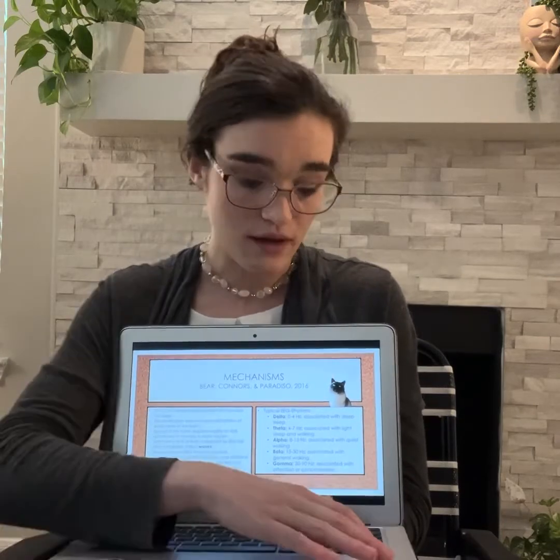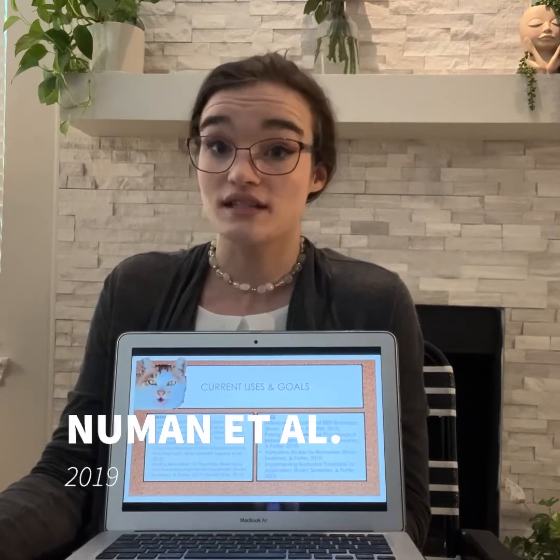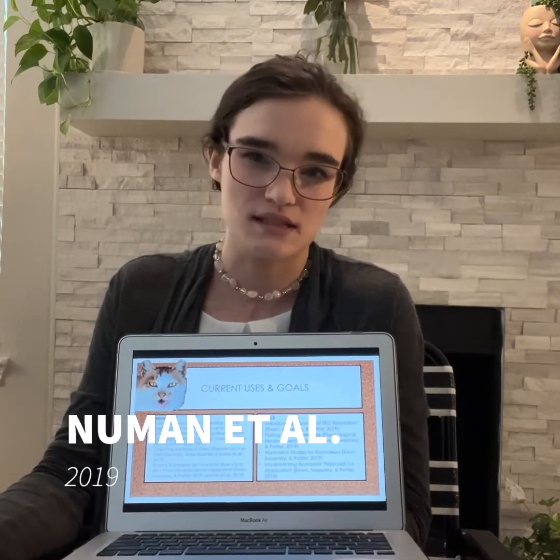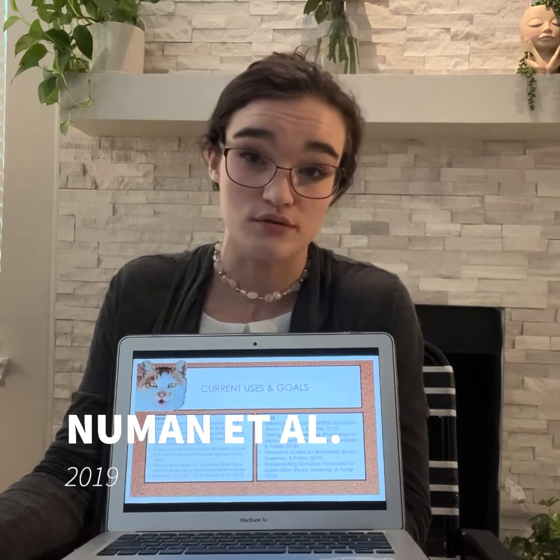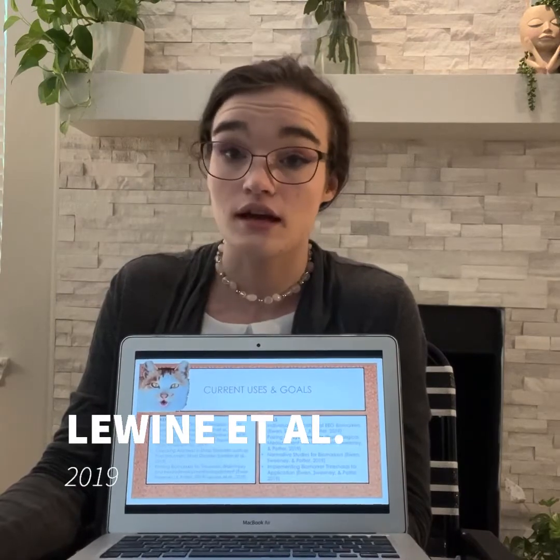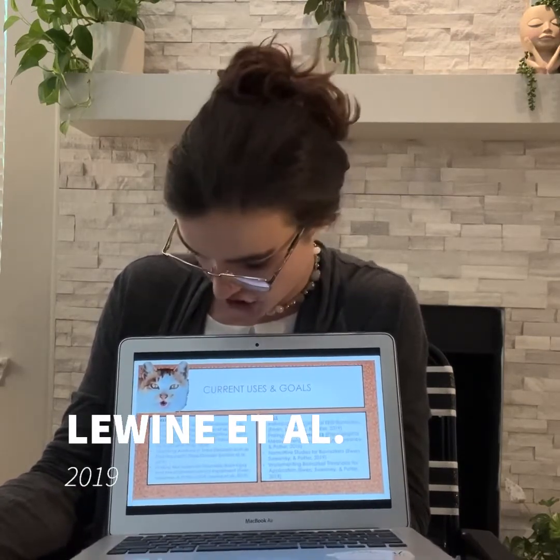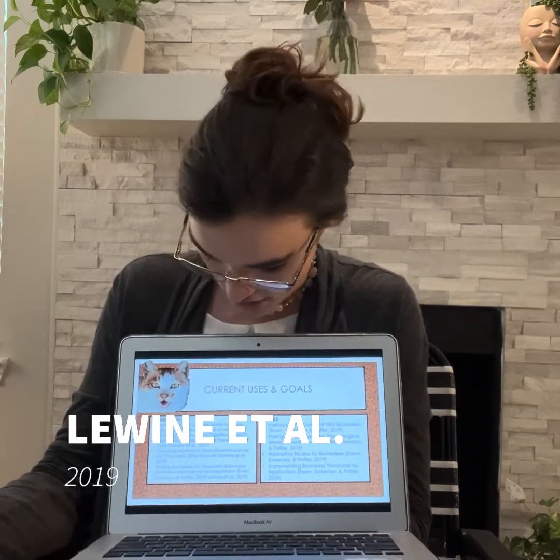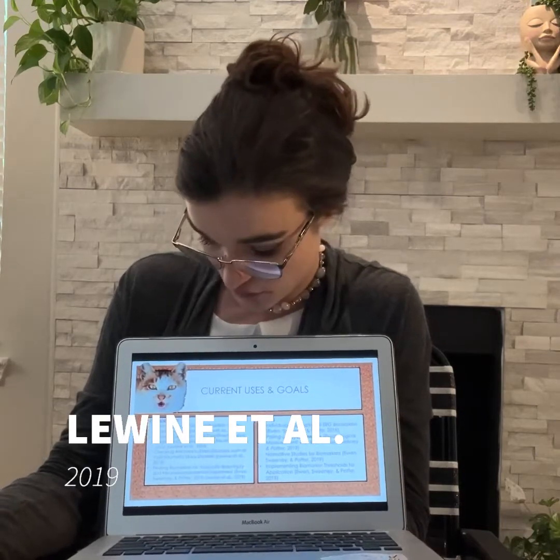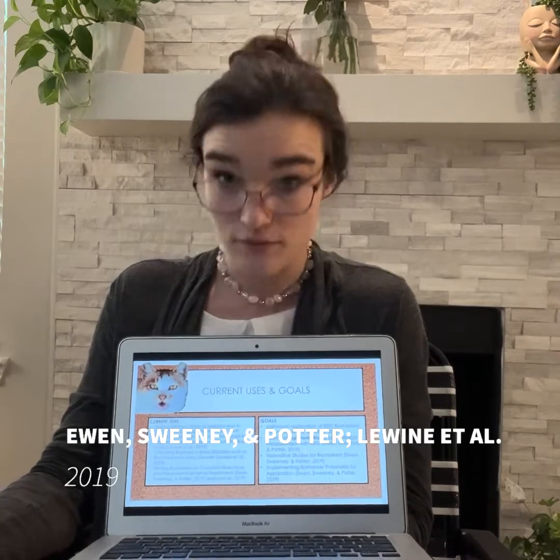So next up, we have the current uses and goals of EEG. EEG has plenty of current uses. As of right now, it's used to test different states of sedation, which may differ either due to medications or states of sleep. It can be used to check attention and cognitive speed in injuries or cognitive deficits, such as traumatic brain injury. It can also check alertness in stress disorders, such as post-traumatic stress disorder, which is known for hypervigilance. And it's used to find biomarkers for several diseases.